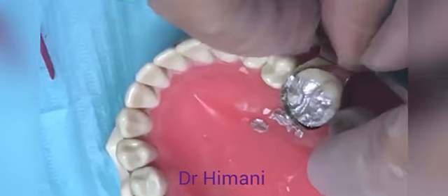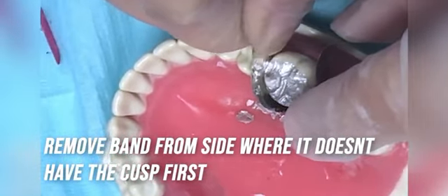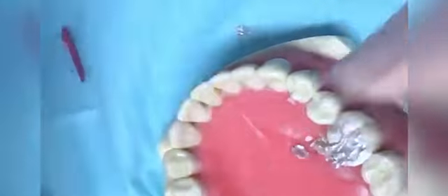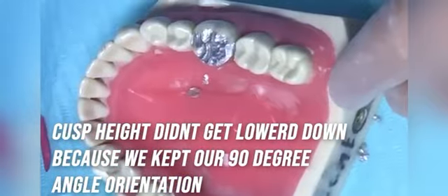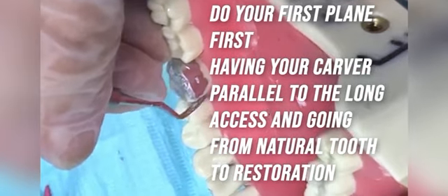Hi guys, let's have a small video on how to do the basic anatomy once you're done with the amalgam restoration filling. So try to condense your amalgam perfectly. Do it increment-wise and use proper pressure until your wrist hurts. While you remove the band, I suggest do not remove the wedges, because the chances that the amalgam breaks are high.